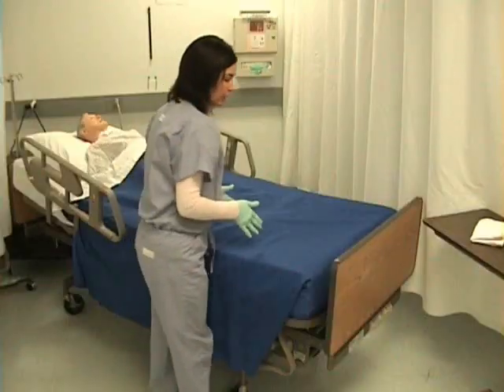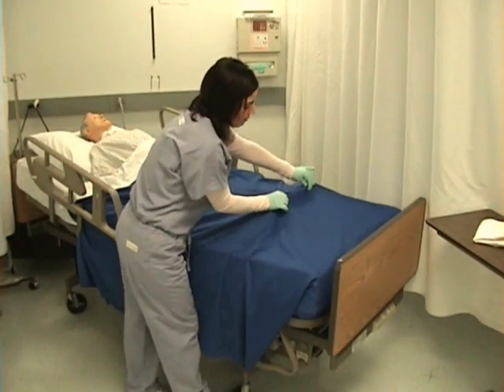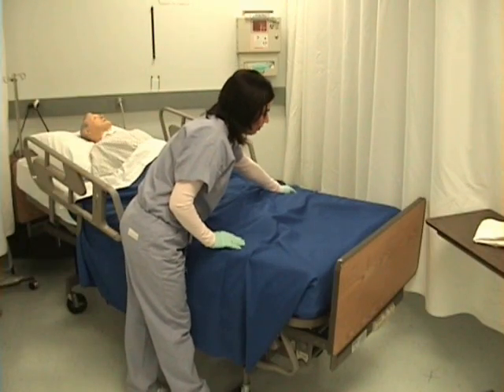After doing this on the other side, I will loosen the sheets and blanket at the bottom of the bed so as to prevent foot drop for my patient.